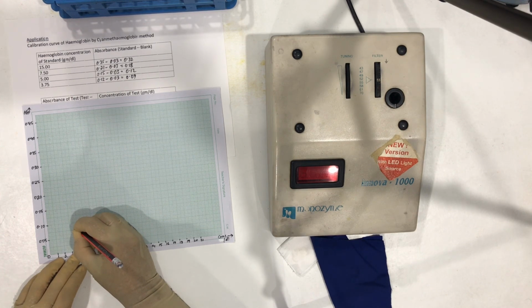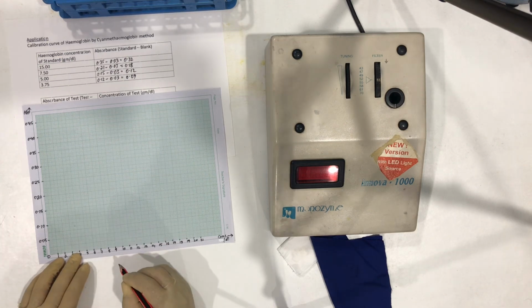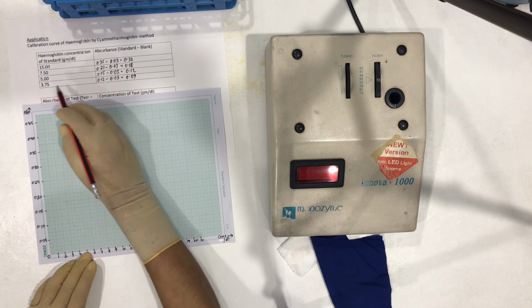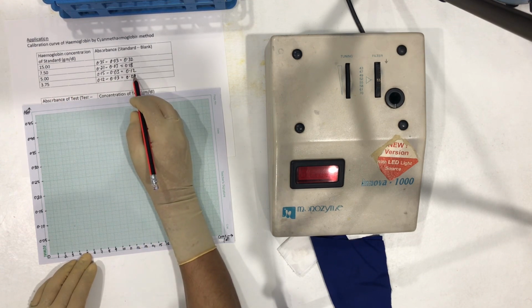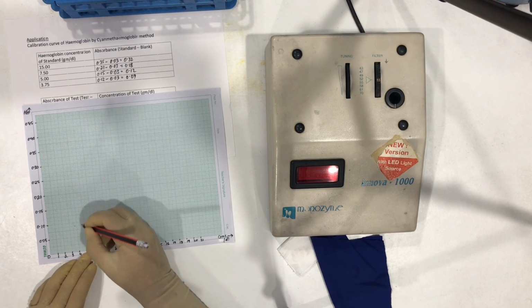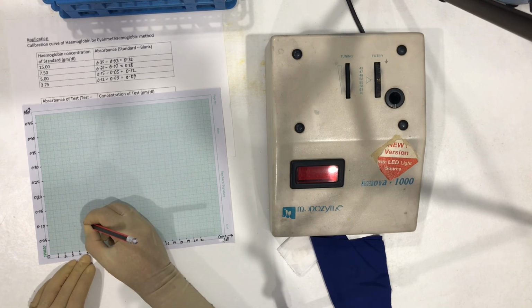It is going to be out here. Standard 5 is giving absorbance of 0.12. This is out here.